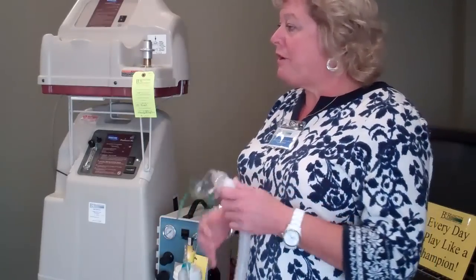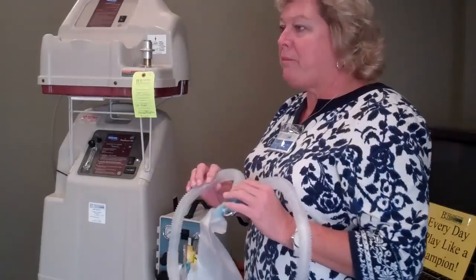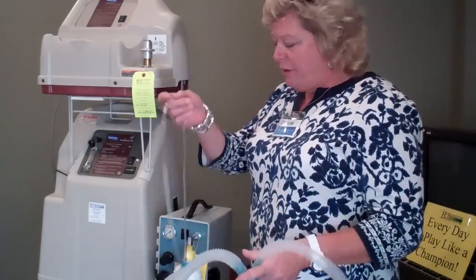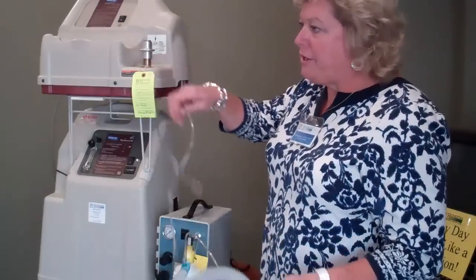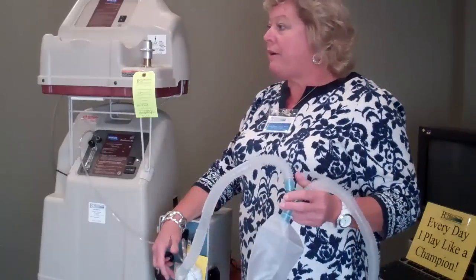Some of the parts that you're going to need are the trach mask, the corrugated tubing, a drain bag to pick up any moisture that comes from the mist bottle, and the blue connector which you hook your oxygen to. If they're on oxygen, you're going to hook it directly to your concentrator. And you have your nebulizer bottle.